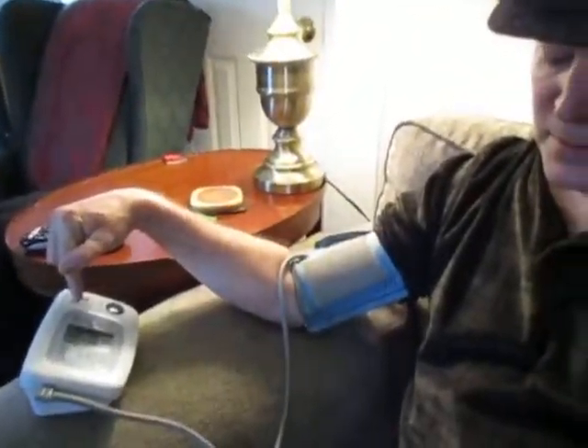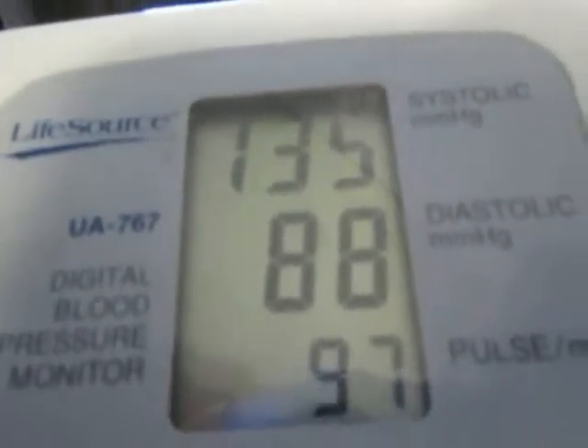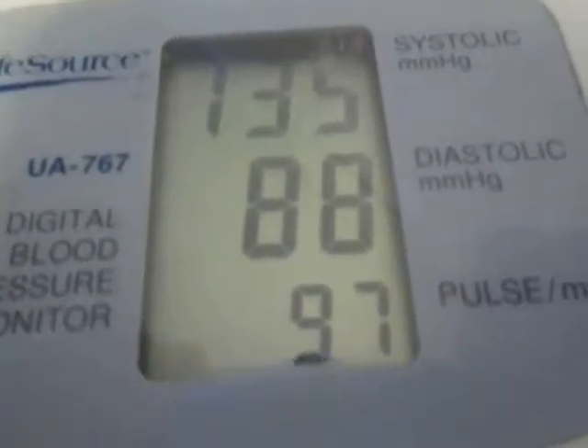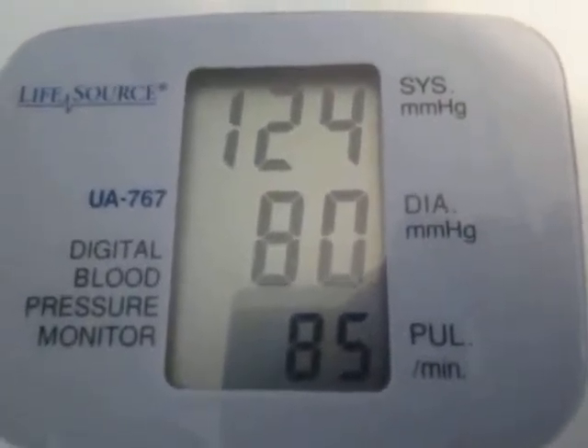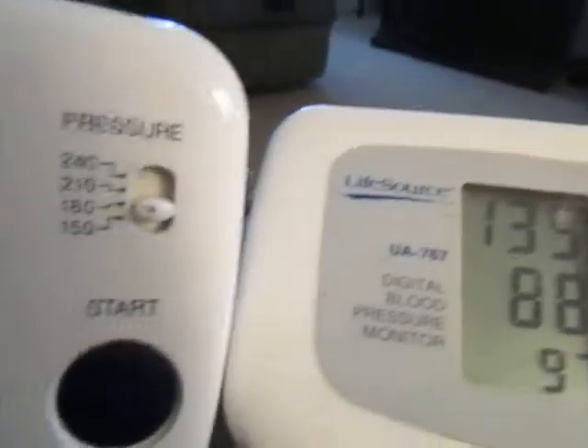Okay, that one stopped first. On my right arm it says 135 over 88, 97 pulse. Over here on the left arm it says 124 over 80, 85 pulse. You don't believe me? I'll put them together — yeah, and they're the same machine.